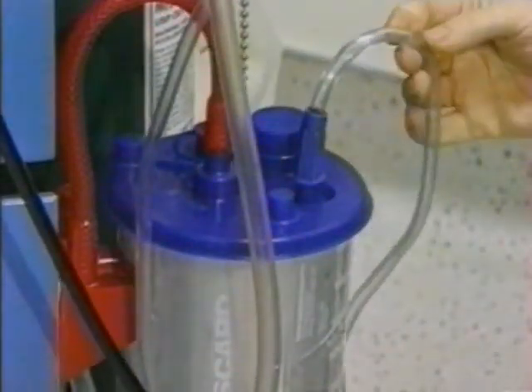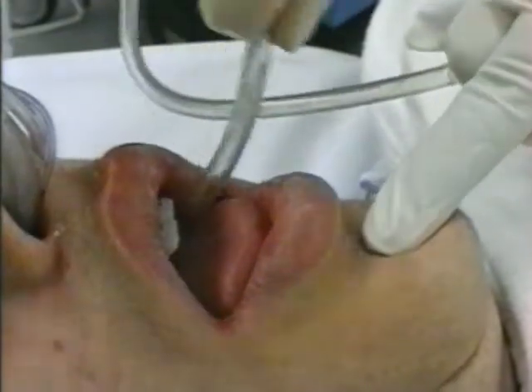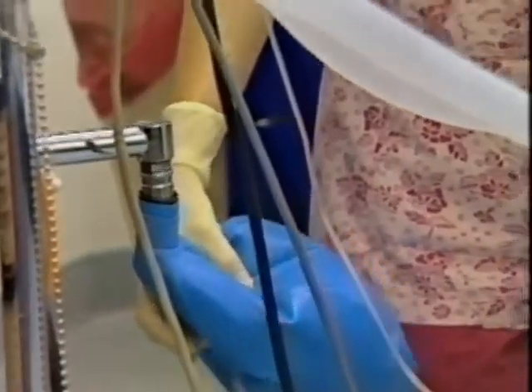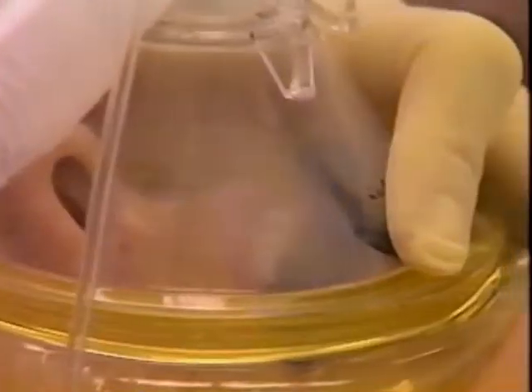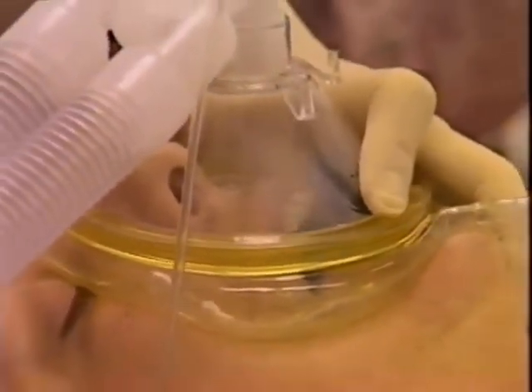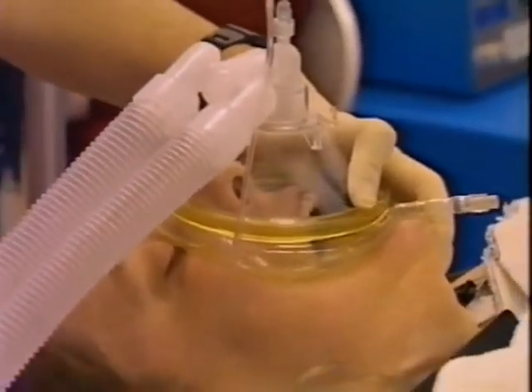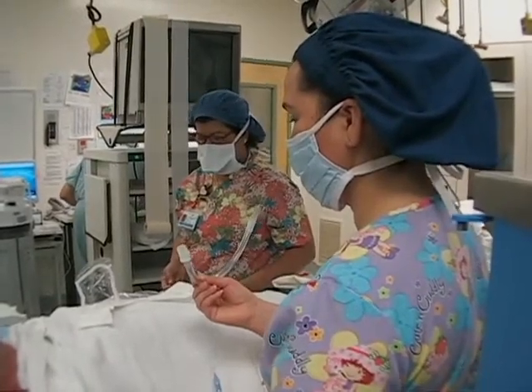Always have a suction device available. Blood or other secretions can cause aspiration or obstruct your view. Ventilating the patient is especially important. While the absence of an endotracheal tube rarely harms a patient, the absence of adequate ventilation can. Always be prepared with a ventilation bag and mask device and oral airways. Intubation is not a one-person job. Try to have a helper present.